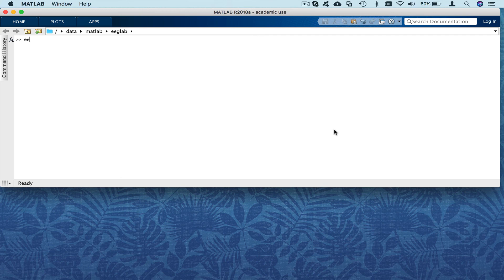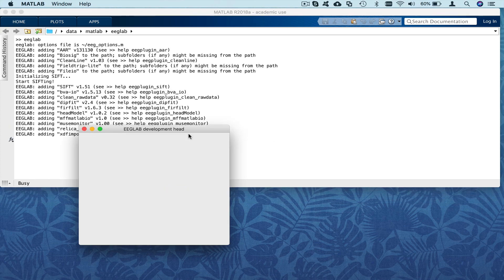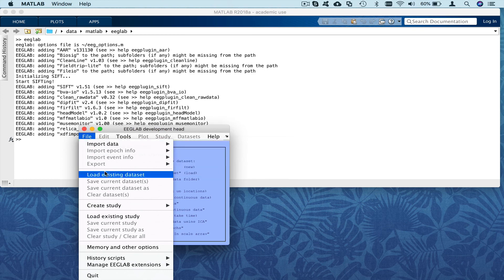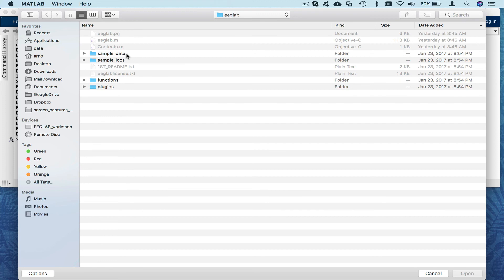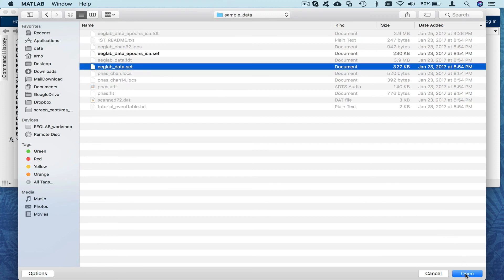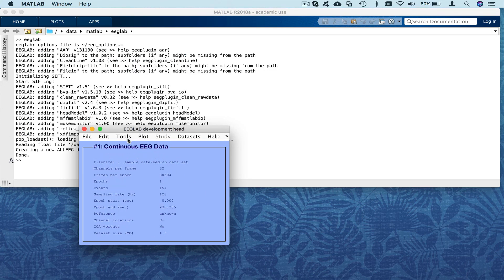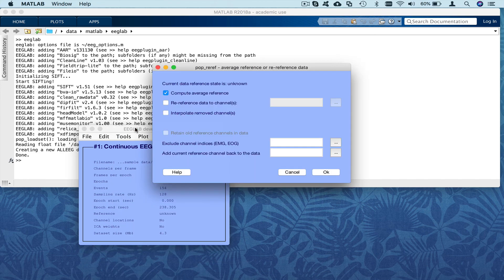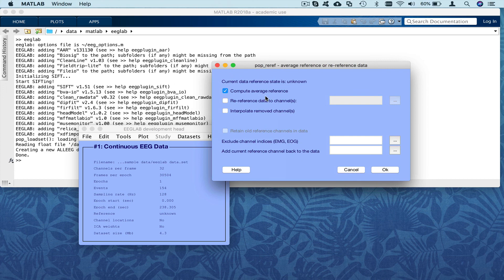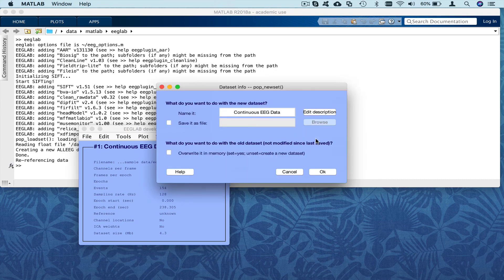I'm going to illustrate this in EEGLAB. Starting EEGLAB again, I'm going to load a dataset from the sample data folder — the dataset saved just after importing. First I'll compute average reference: select Tools > Re-reference > Compute average reference. The original reference for this dataset was the right mastoid TP10, but the left mastoid was not recorded, so we don't want to add it back to the data as it would be imbalanced between both sides. We'll just compute average reference without adding the current reference back. After referencing, this is a good time to save the data as a file — here I'm just going to overwrite it in memory.